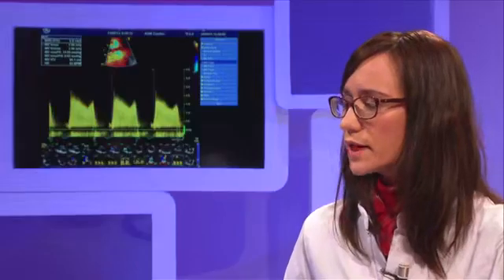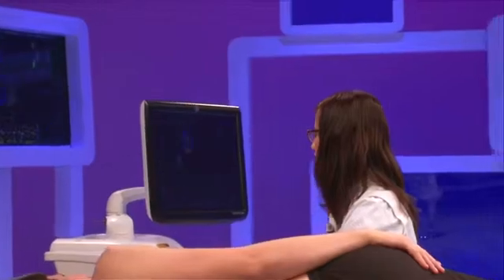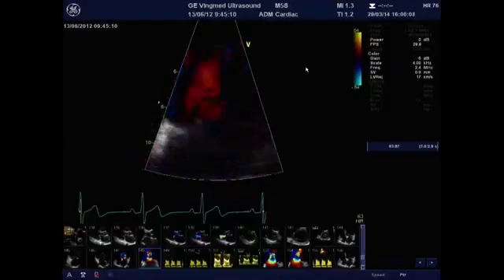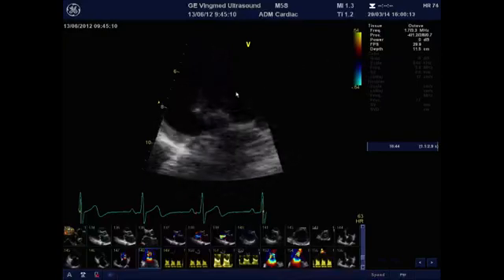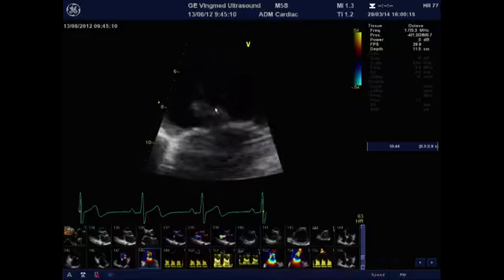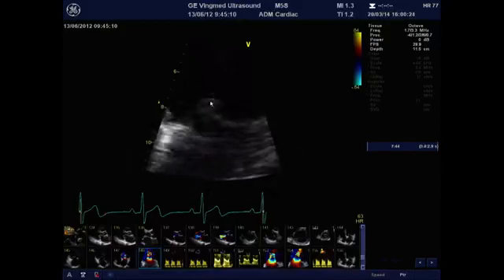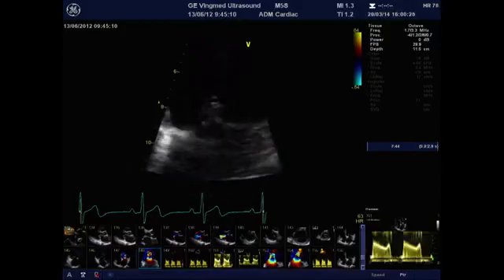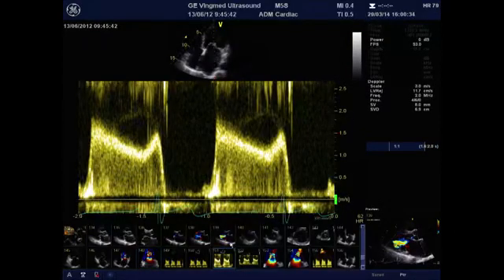The third modality that you can use to assess the mitral stenosis severity is what we call the pressure half-time. Again, the pressure half-time has to be measured in one of the apical views, whichever you feel best. The secret is just to see which leaflet tip opening has the smallest orifice, and then to put your pulse Doppler exactly at the level of the smallest opening of the mitral valve. And you'll have a tracing like this one, in which you see a very nice slope.